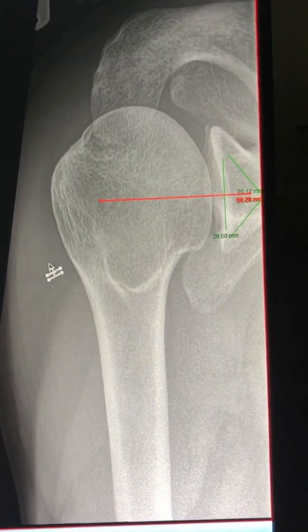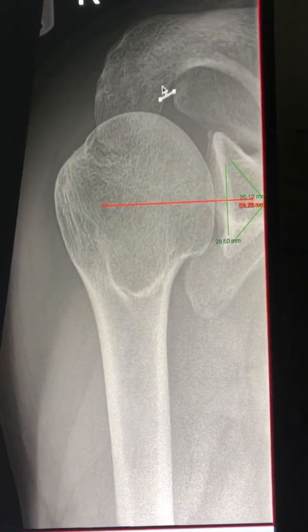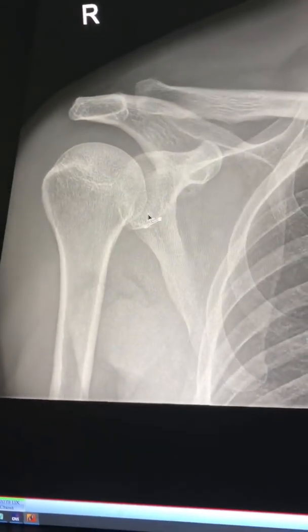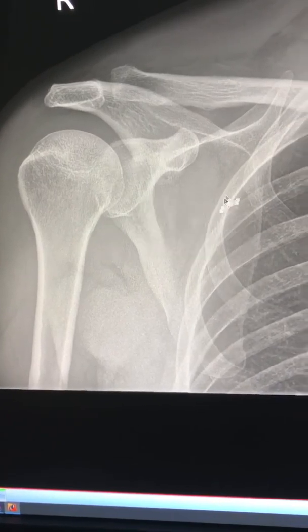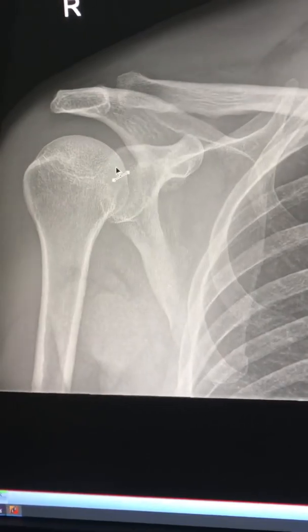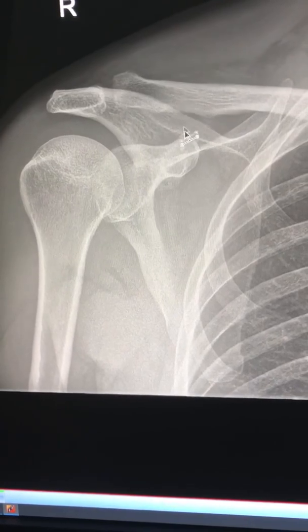Look for any fractures and check for cortical continuity with no breaking of cortex. To summarize, when reporting a shoulder X-ray: look for cortex integrity and fractures, look at the clavicle, look at the ribs, look for pneumothorax, and check joint alignment — especially the glenohumeral joint, AC joint, and coracoclavicular ligament distance.